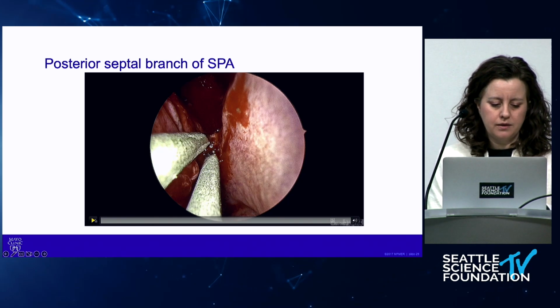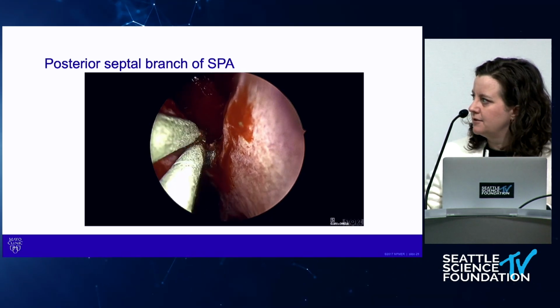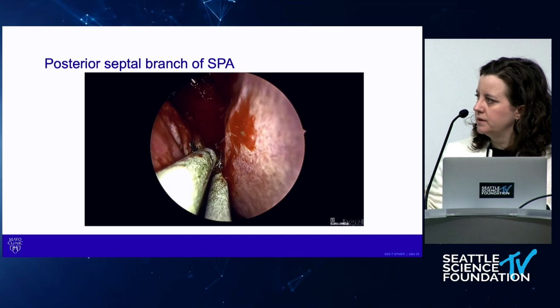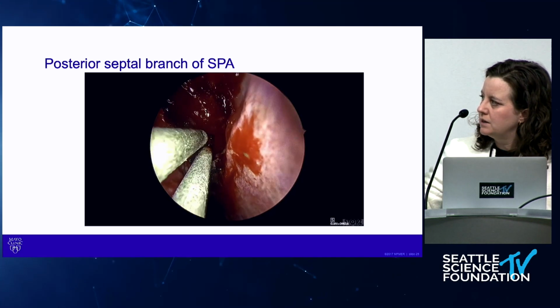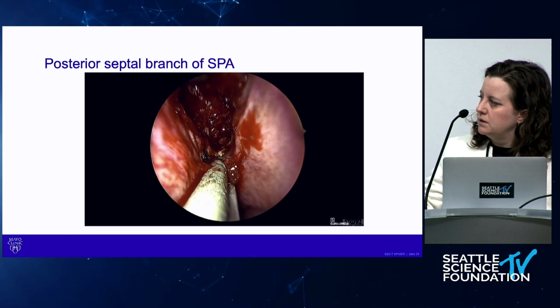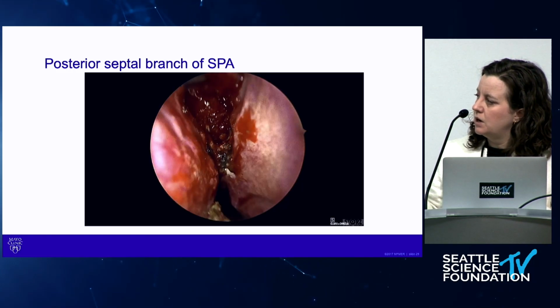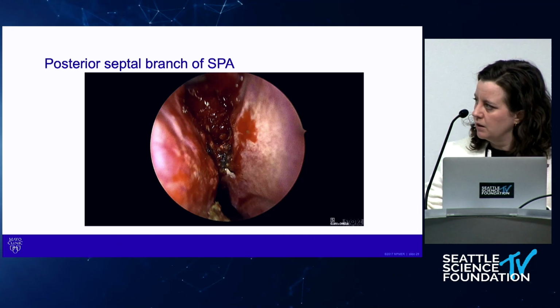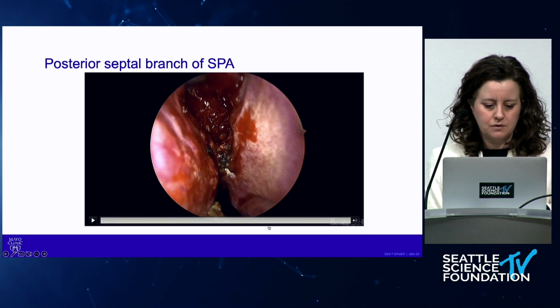On all of the sinus sets we have these bayoneted bipolars. They're not my favorite, but they're on every pan, and the cord is always available, and I have them. So on that last gentleman where I showed I was doing the sphenoid, we had to cut down pretty low to get this fungus ball out. This is a gentleman I don't want to have a bad bleed. He's elderly and he lives 4 hours away from Rochester. So I went ahead and cauterized that. So have some cautery on your set available to get that branch if you're doing a sphenoid and coming down low.